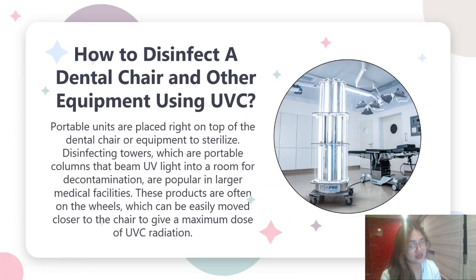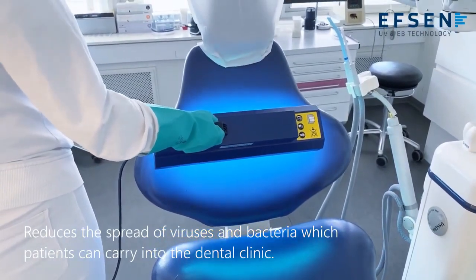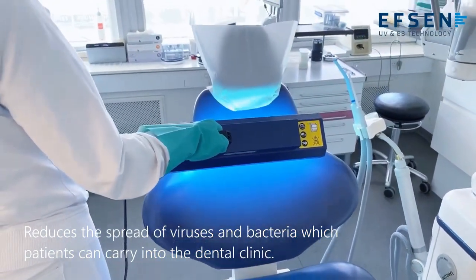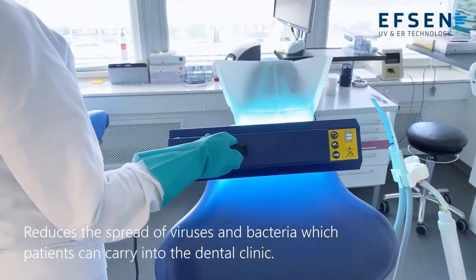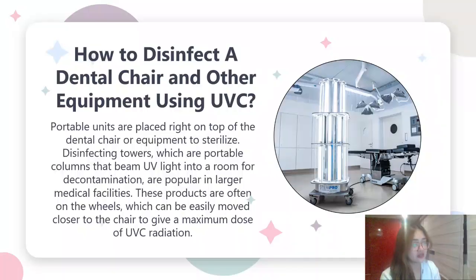How to disinfect a dental chair and other equipment using UVC. Portable units are placed right on top of the dental chair or equipment to sterilize. Disinfecting towers, which are portable columns that beam UV light into the room for decontamination, are popular in large medical facilities. These products are often on wheels, which can be easily moved closer to the chair to give a maximum dose of UVC radiation.